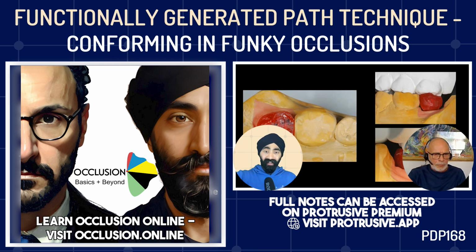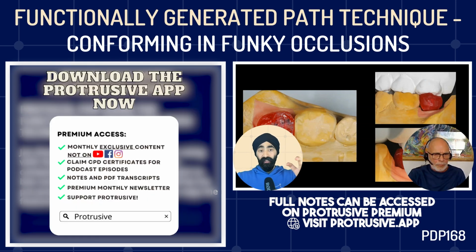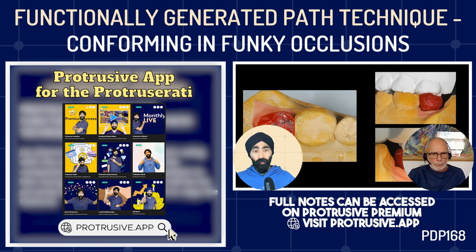So when I've scanned that, that scan and the prep scan both make their way to the technician digitally, and I tell the technician to biocopy or copy the features, or here's some clues for you to make sure we get the bite right. Oh, by the way, here are the shim holes, and I found that that's worked really well for me and my technician. So you can actually use this on teeth as well, or when you want to do a digital technique. I guess you could even take an impression of that and send it to the lab if you wanted to, maybe a triple tray impression, and capture that as additional information for the lab.